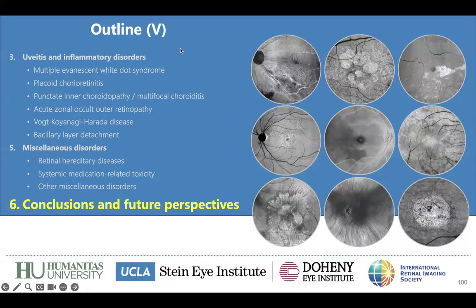But you can. Okay, so we usually use the Solix here at UCLA with Dr. Saraf, so I have more experience with that, and I think it's great. I also know that Plex Elite is great. Dr. Freund, for example, in New York uses that. There are so many different devices, and it's so interesting to use them. Each of them has, of course, advantages and disadvantages, especially in terms of time-consuming nature. I think this is important, but also the ultra-widefield capability and segmentation artifacts. I think these are the most important points with the different devices.